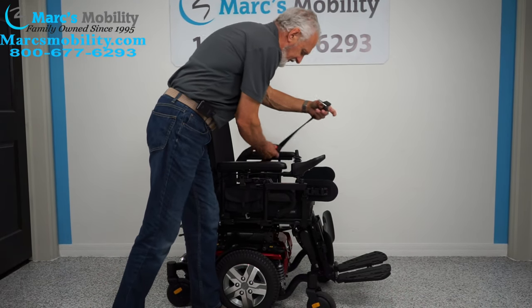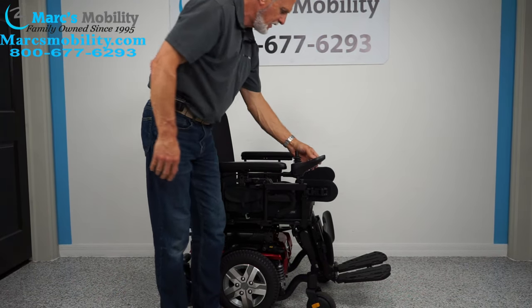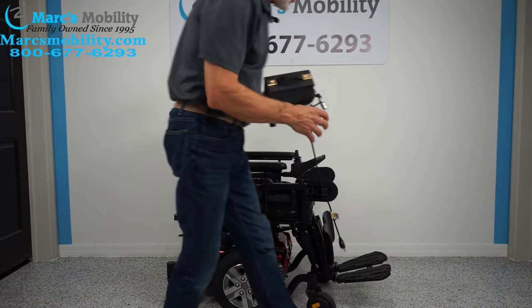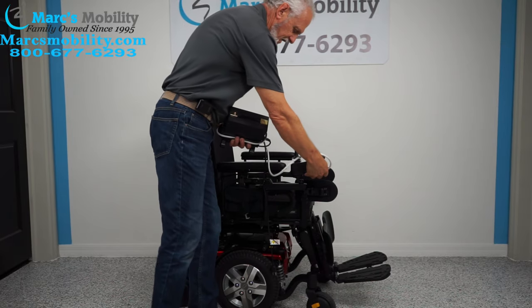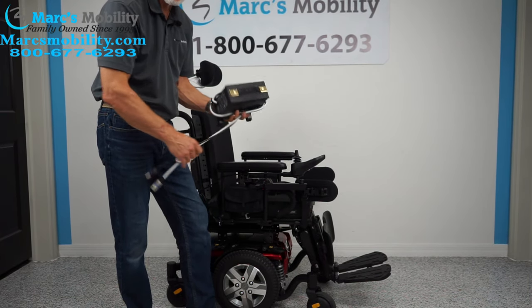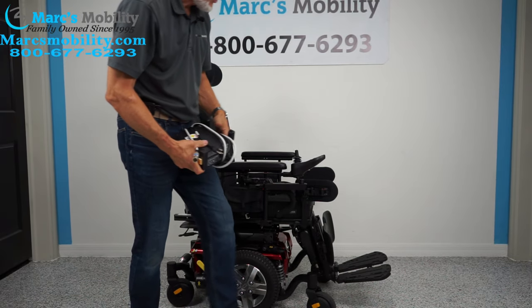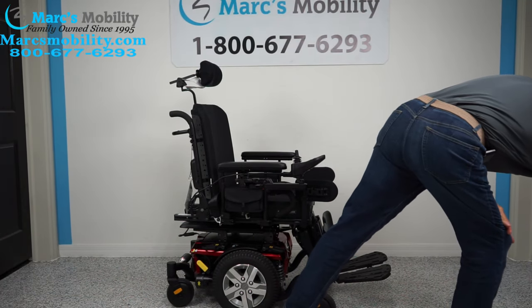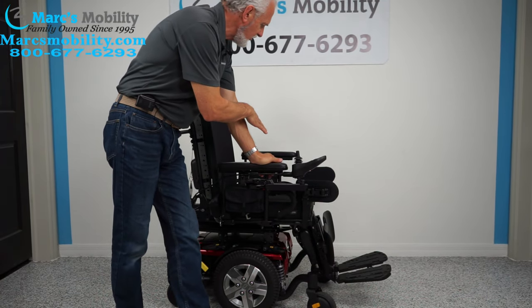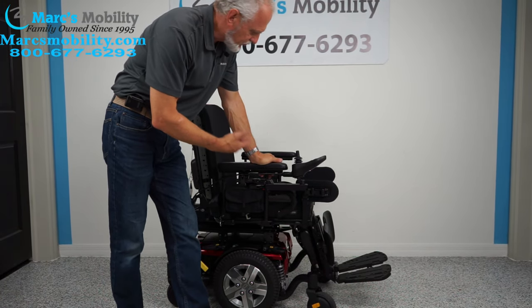You do have a safety belt. When you charge this chair, you plug the charger right below the joystick. As soon as the light goes from orange to green, you're fully charged. The batteries in this chair will take you about 15 miles on a charge — that depends on the weight of the user and how you drive it.